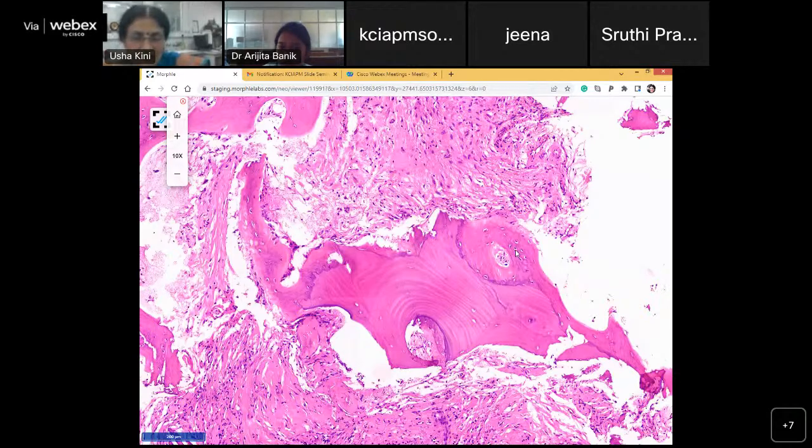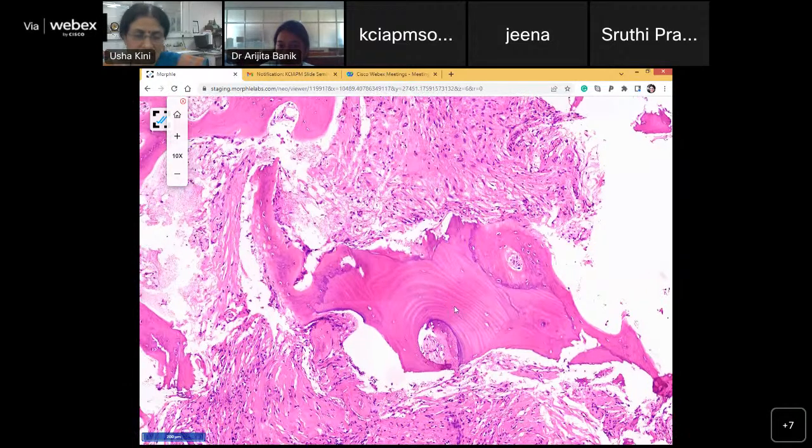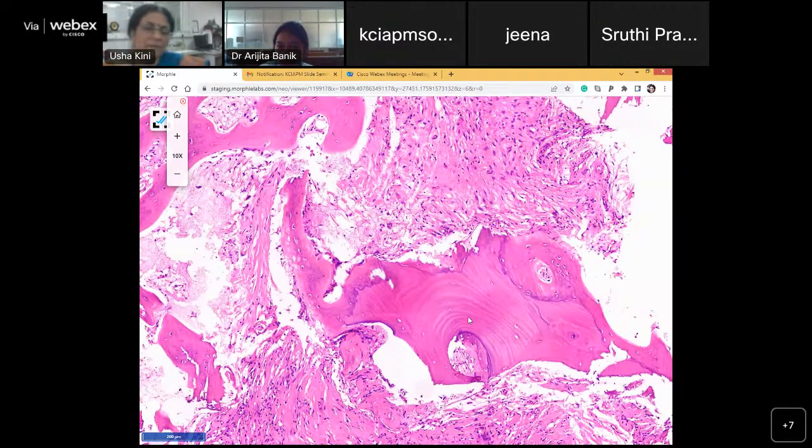These are the osteocytes, right? Yes, ma'am, within the lacuna. So to tell you that this tissue is viable, right? So you see the lamellae. This is of the long bone. Which bone are we talking about? Yeah, ma'am, left lateral condyle of femur. Femur.